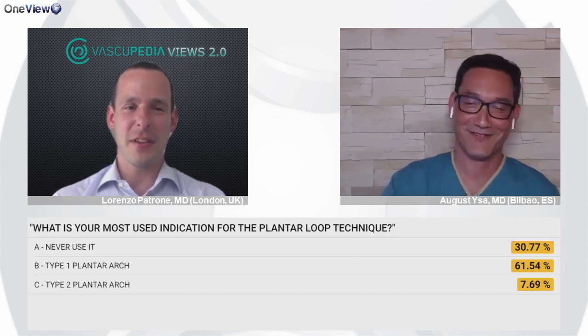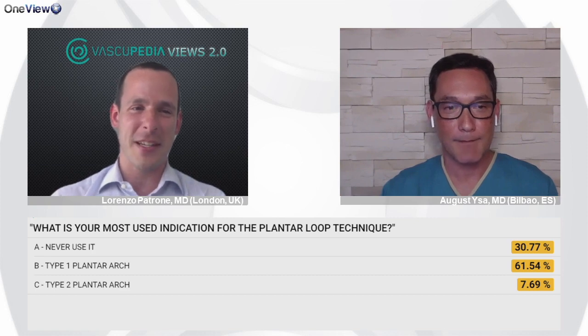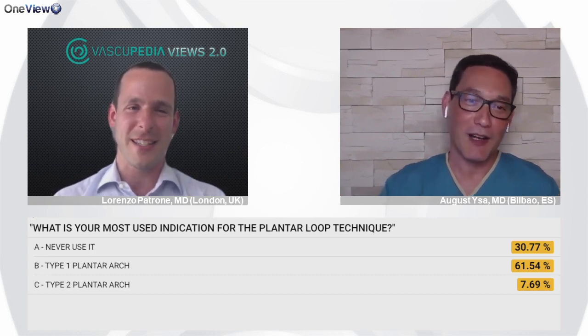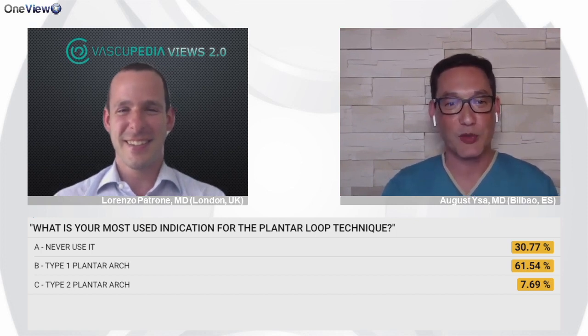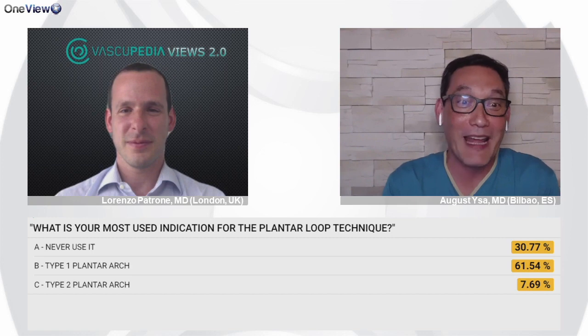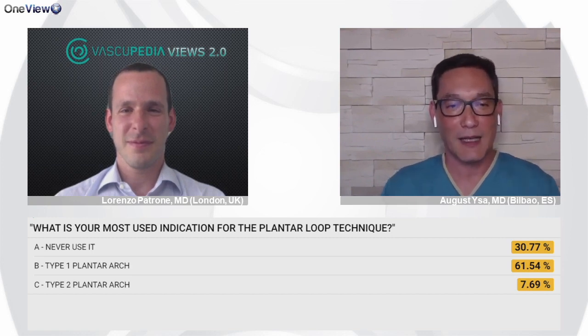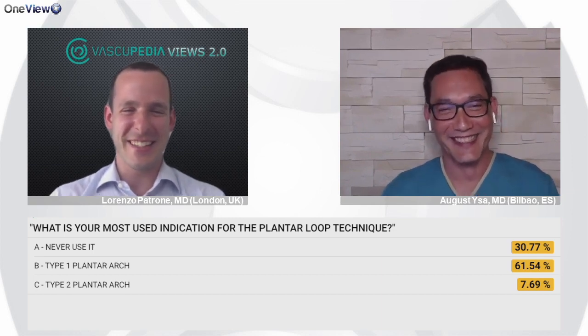And also I've seen some cases where you puncture antegrade the dorsalis pedis, or even the posterior tibial, to recanalize the arch. Would you tell us more about this technique? How many times do you do it? How much is successful? No, I don't actually have huge experience, and this is a sort of bailout you perform once or twice in your life, because you really get trapped and you just need to do whatever. But I would not recommend to do that at home. Don't do that at all. Disclaimer. Okay, great. Thank you.